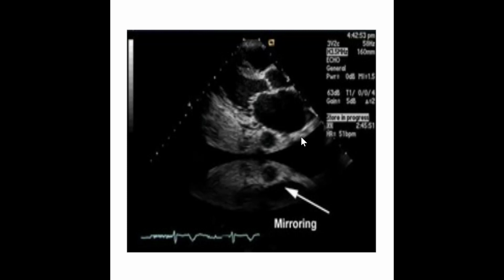Here's another example. This is of the heart. Again, we have our specular reflector area through here. This is all going to be lung around the heart, and we can see an exact replica occurring. The artifact is a part that is deep in the image. Here's another example using blood vessels. We will see this occur with this as well.